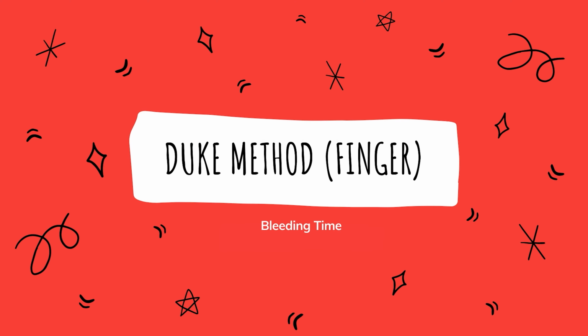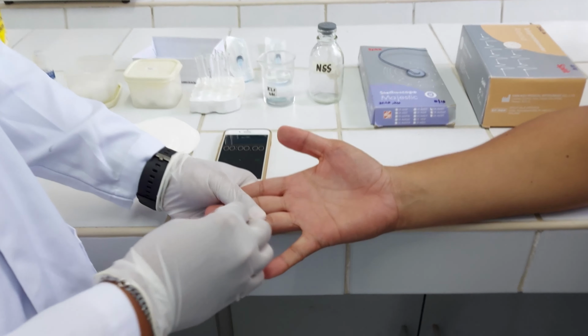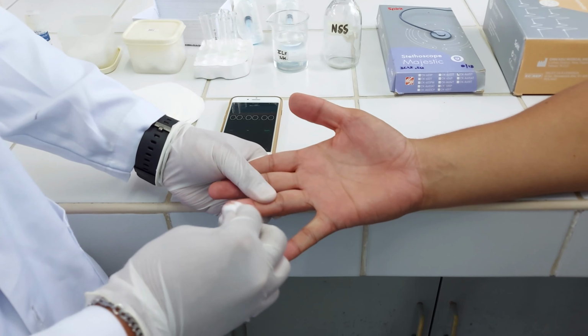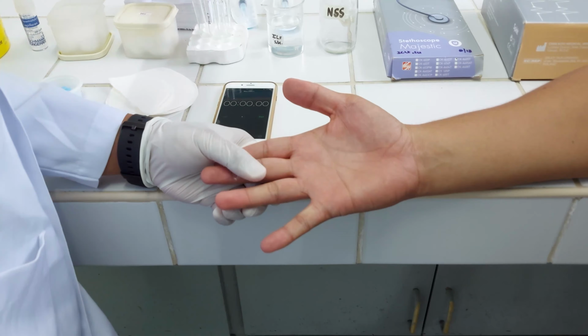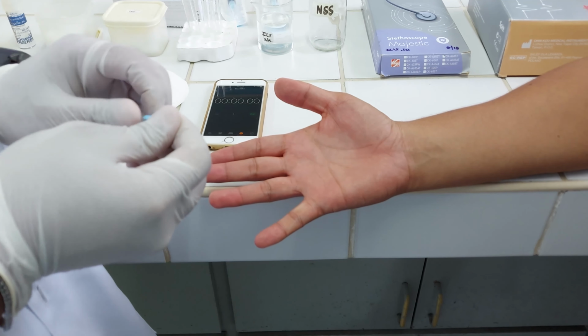The next method is the Duke method in the finger. It has the same procedure as the first method. Clean the site with alcohol and allow it to dry, and after making an incision 3 millimeters deep, blot the blood with filter paper at 30 seconds interval.